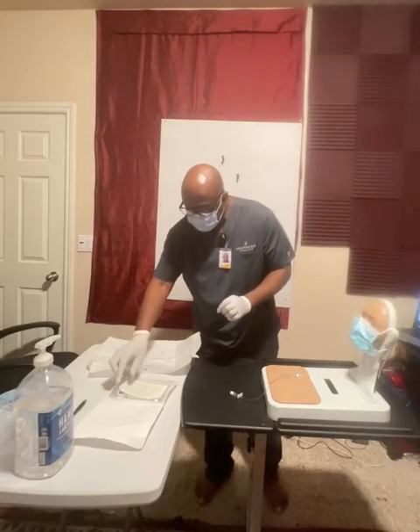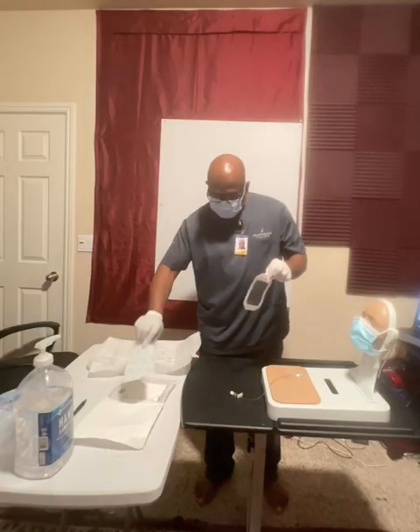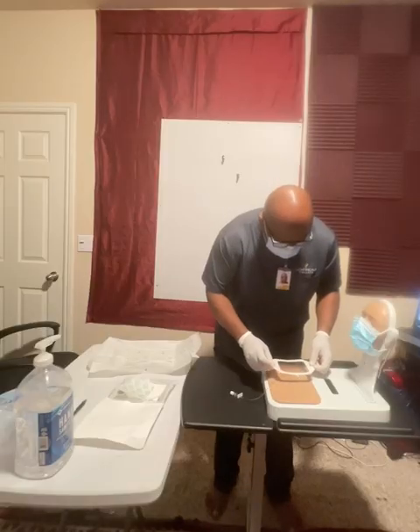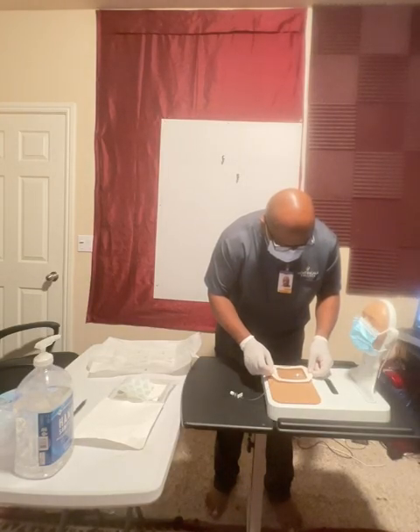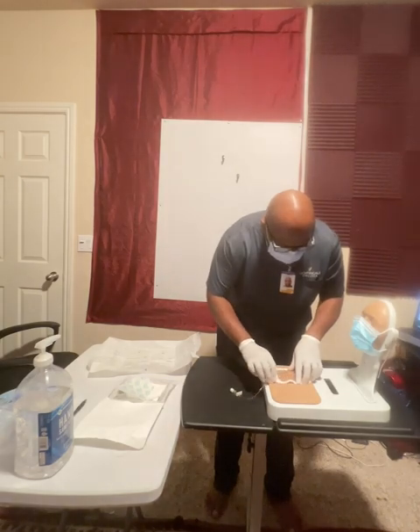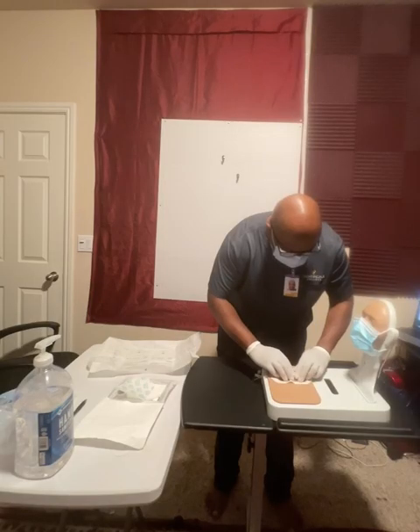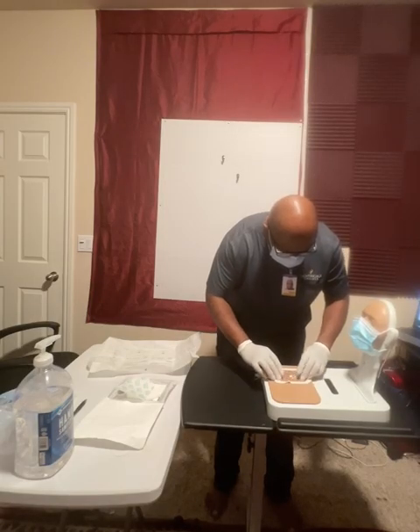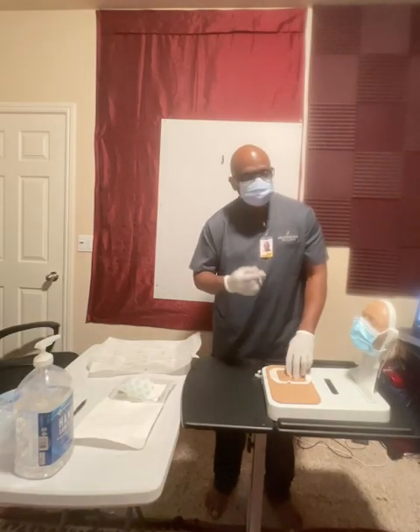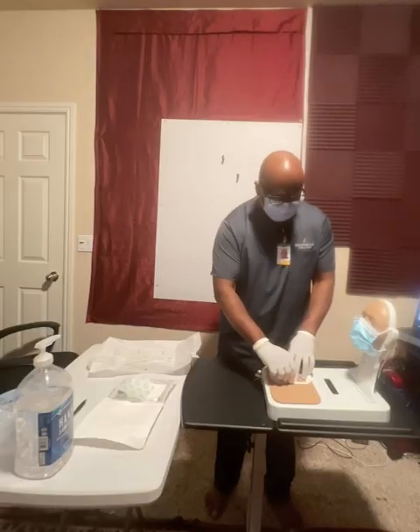We're going to go ahead and take the brand new Tegaderm. We're going to peel that off, and we are going to cover this up. We want to make sure that we have a visual on the actual catheter site, and make sure that the tube is in a good spot. Make sure the tube is good. We want to get rid of all air bubbles there. Now we can go ahead and peel it off. We want to be able to see the catheter site. That way, if there's anything forming, any pus, we'll be able to look at that, document that, and communicate with the doctors going from there.